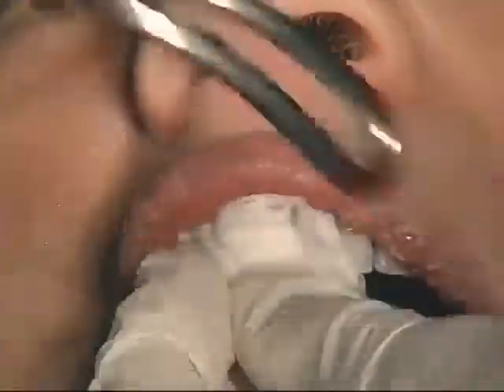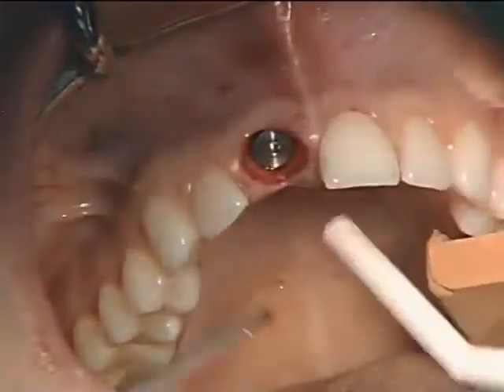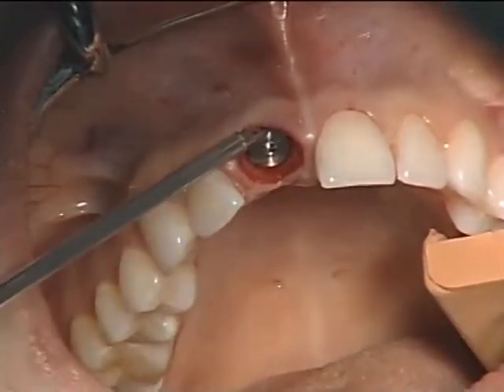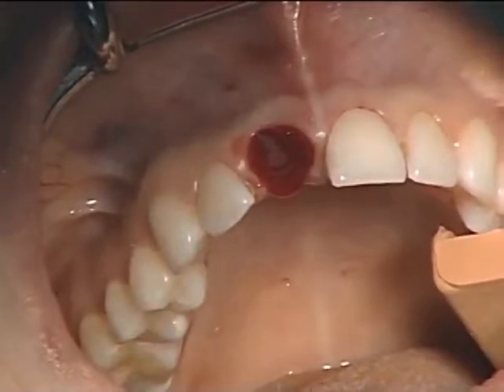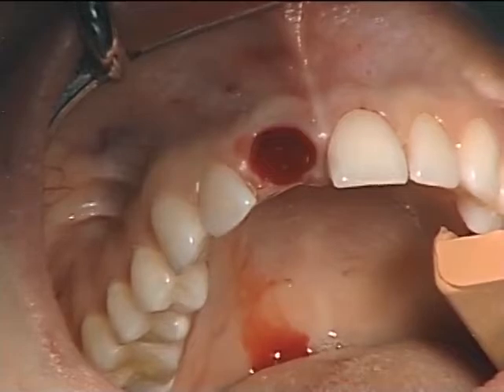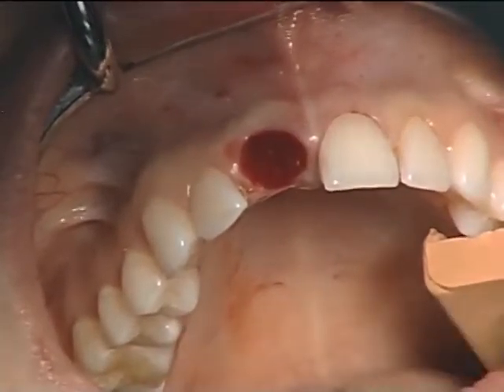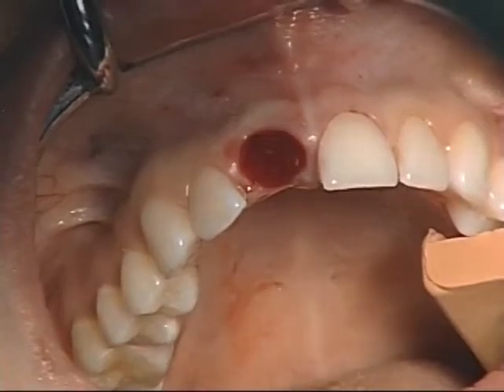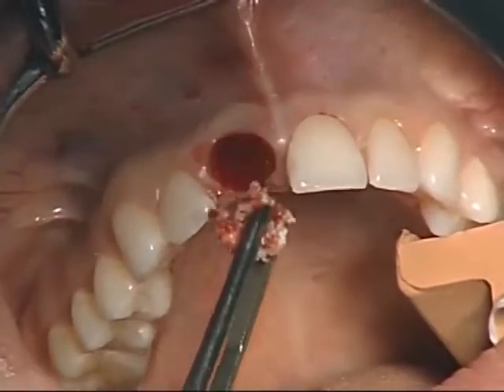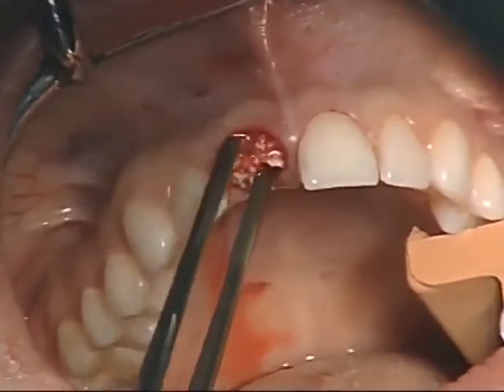And the graft substrate is then constructed. Prior to placement of the graft, we will put an application of platelet-rich plasma between the implant surface itself and buccal plate. And then we will go in with our grafting material, the Puros. We first place into the pouch that we created prior to implant placement, and then go to our modified GAR elevator, which will be part of the Petrongaro elevation and extraction and grafting kit. And this gets condensed between the buccal surface of the implant and the buccal plate.